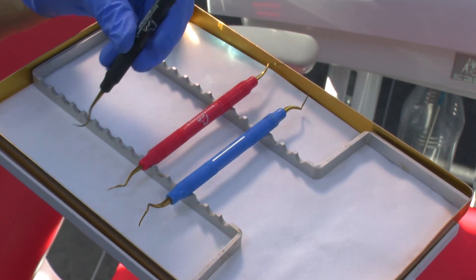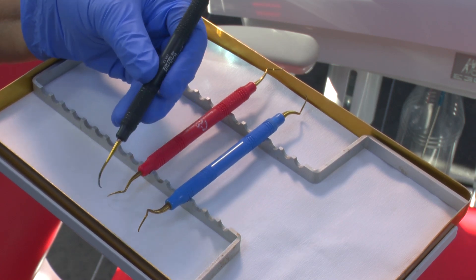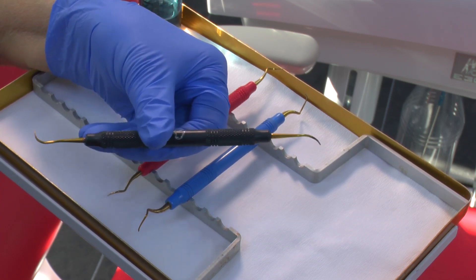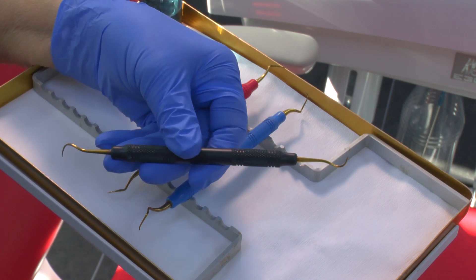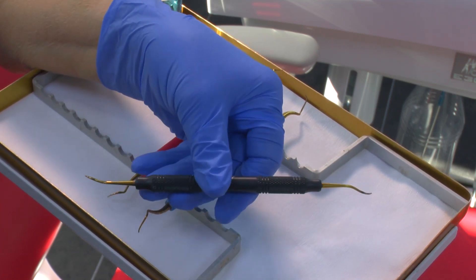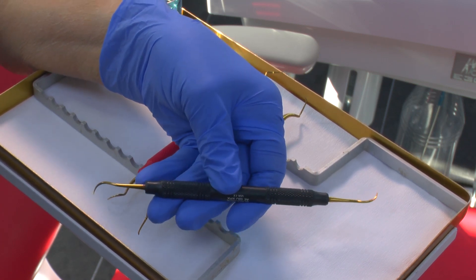These are some other of my really favourite instruments — they're American Eagle. This is a Blackjack. The Blackjack is very similar to the Montana Jack, but this has a coating on the instrument so that it isn't necessary to sharpen it.